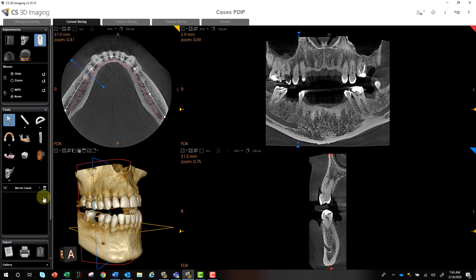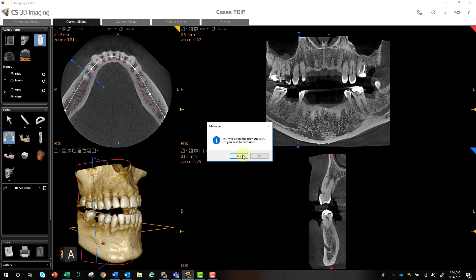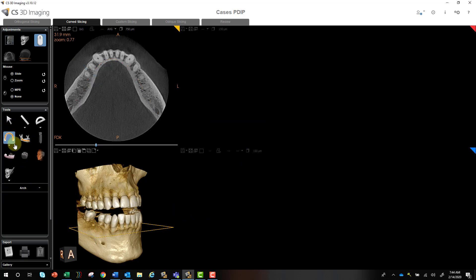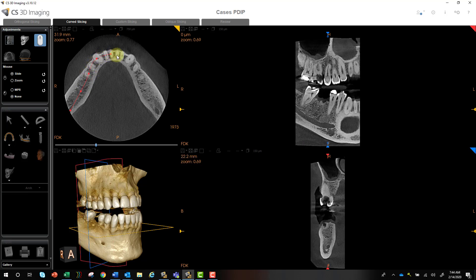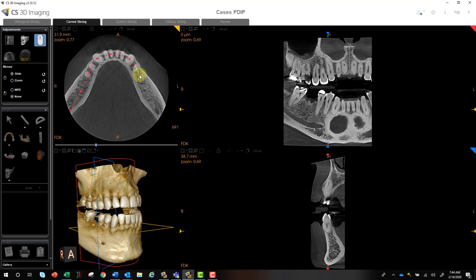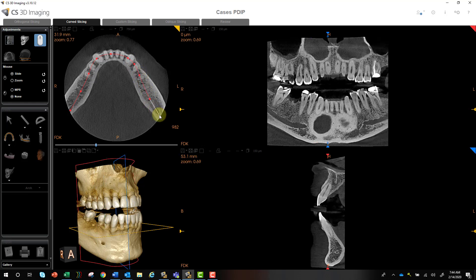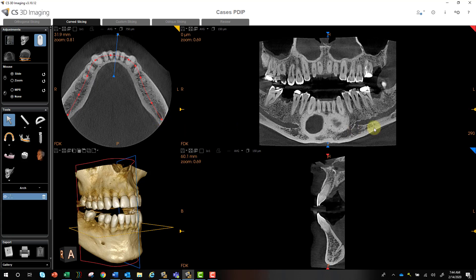The other way is to delete my nerve and also delete my panoramic curve. Instead of going down the center of the bone, let's map the panoramic curve where the nerve generally travels. We'll start off here towards the lingual — you can even see the nerve here — and go up towards the buccal where the nerve travels and around the arch. In my panoramic curve, you can see the nerve is much more prominent in one single view. That's another way to do it, which can be easier, but it's personal preference.